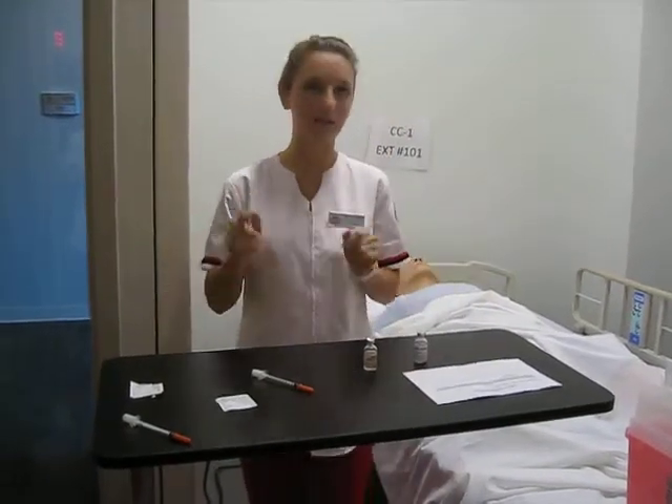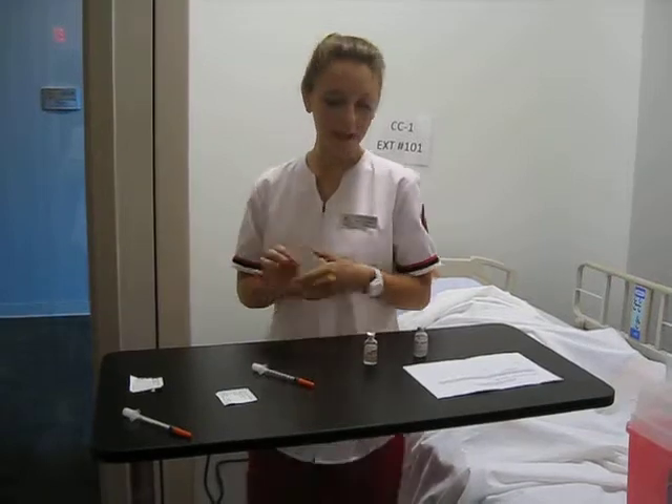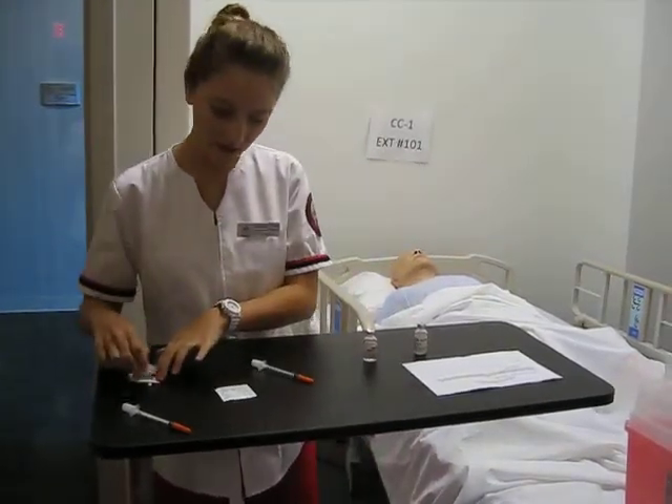Before I get started, I'm going to wash my hands, and I need to clean them with an alcohol swab.